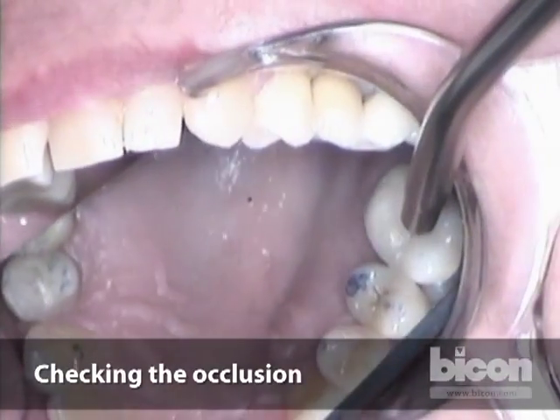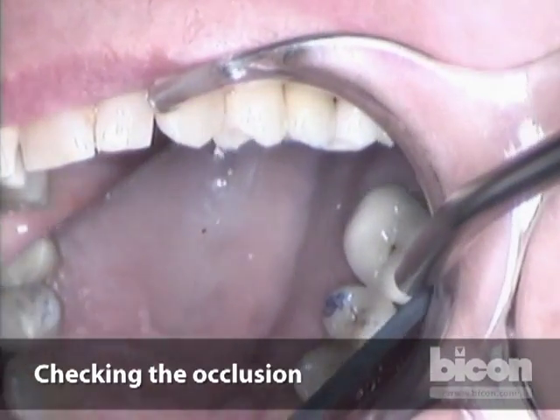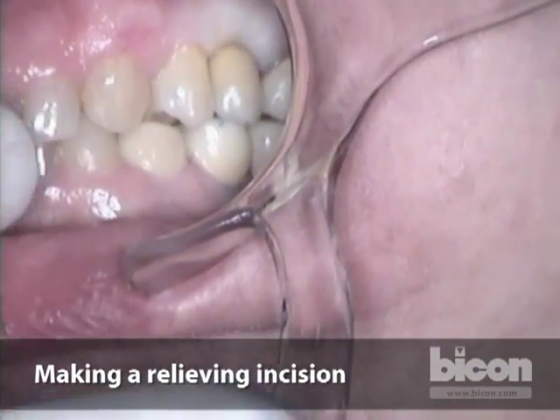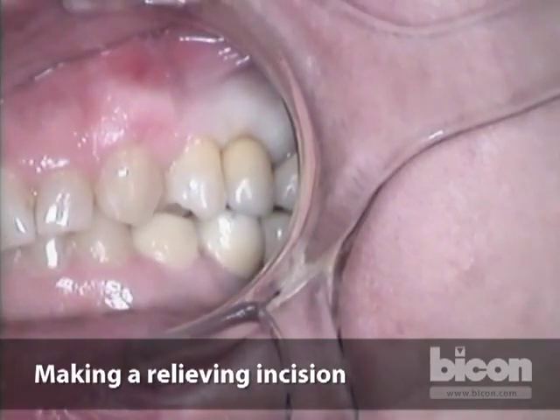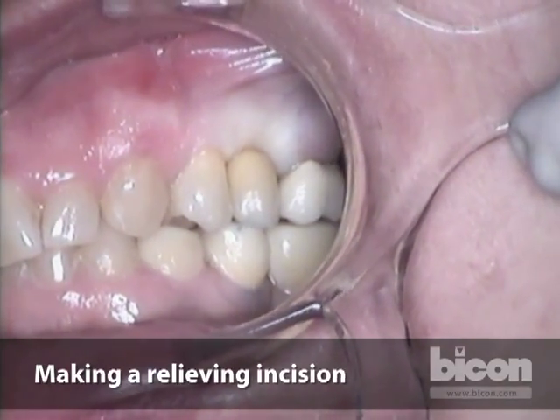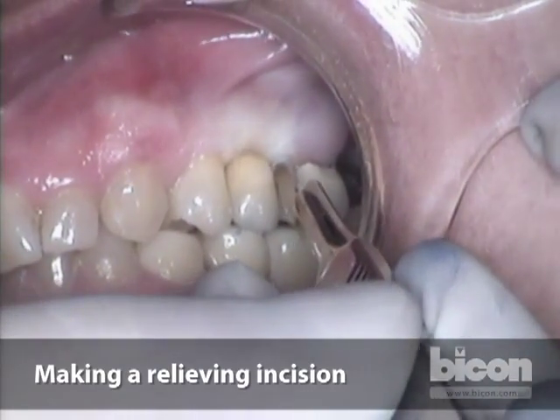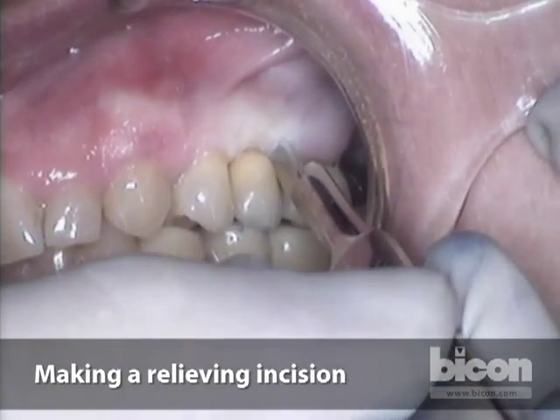It's probably a little heavy because it's on that palatal cusp. It is still blanching because there was no temporary abutment in place. We may make a little relieving incision. For maxillary anteriors you'd want to tap; however, in the posterior, just having your patient close on a Q-tip is sufficient.